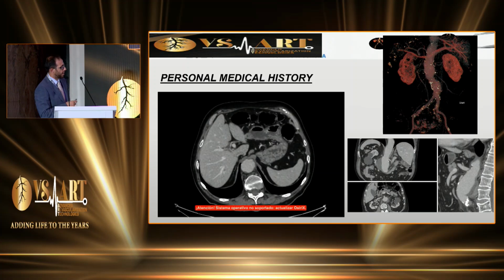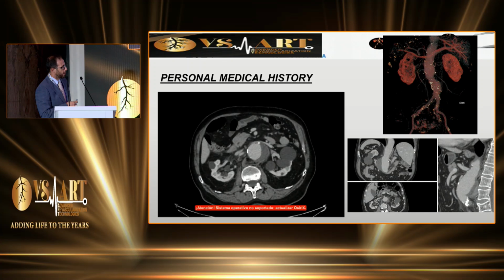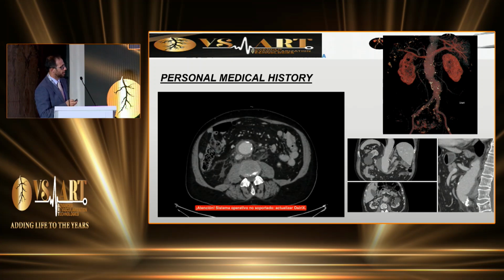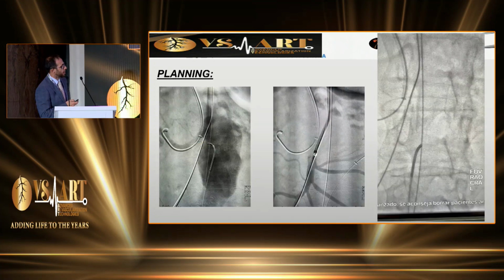You see the large aneurysm, symptomatic, with signs of immediate rupture. The wall of the aneurysm is not well defined, and it is suprarenal. So in this case, I decided to do... I need to go fast. It would take me more time to do four physician-made fenestrations.